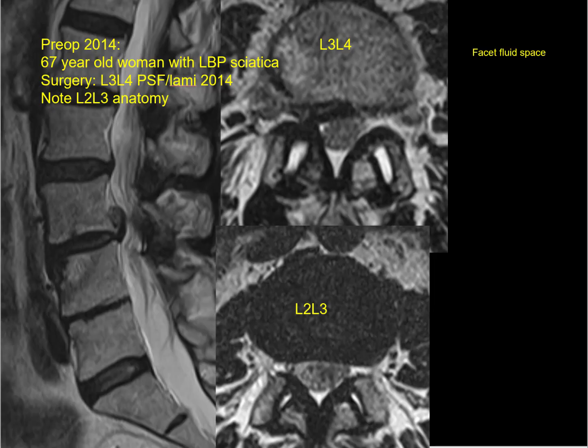Now fast forward 2 more years to 2014, where she's 67 and she had low back pain and sciatica. You can see here an MRI scan that I found. At L3-4, she's reduced now, so there's a dynamic element to this spondylolisthesis. At L3-4, on the axial cuts, top right, you can see fluid within the facets. We used to call this the gapped facet sign, or you can call it fluid within the facets. Basically, it denotes dynamic spondylolisthesis, and she has a right-sided L3-4 disc herniation.